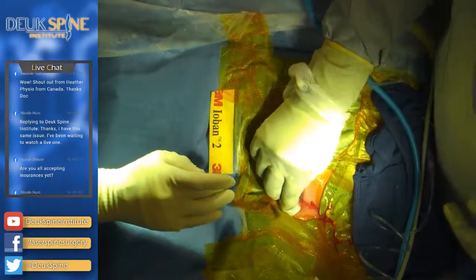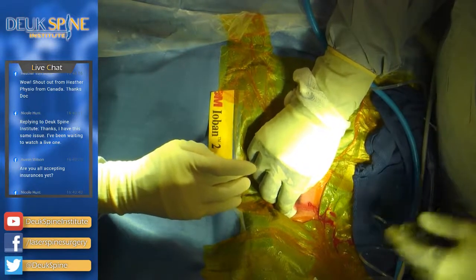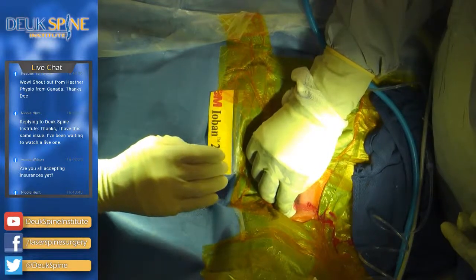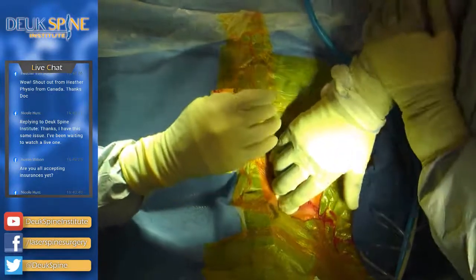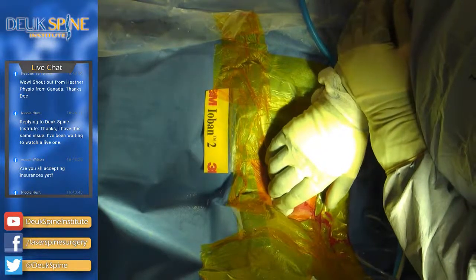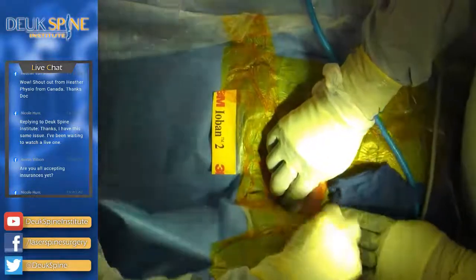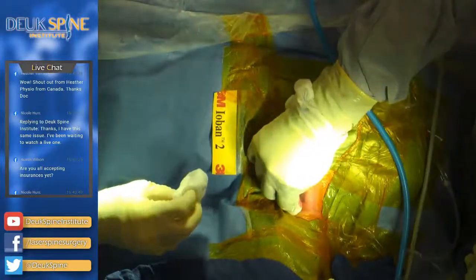The good thing with this surgery is you don't really have a potential space that we're creating, except for the track. This is an athlete, so he's got a lot of circulation, obviously. If you go through a vein or tear a vein in surgery, you just put pressure, usually for about 4 to 6 minutes, and that's all it takes. I was going to show you the incision, but I want to hold pressure for a little bit until it clots off.